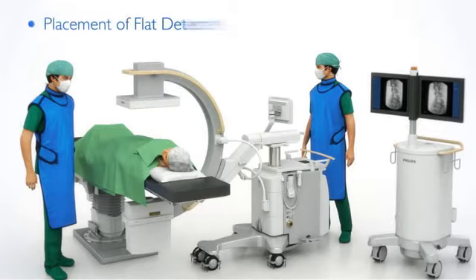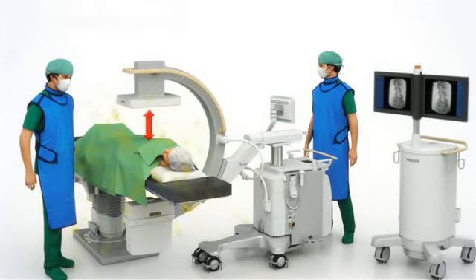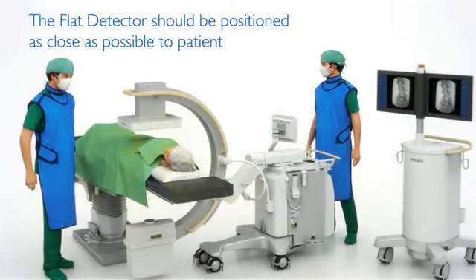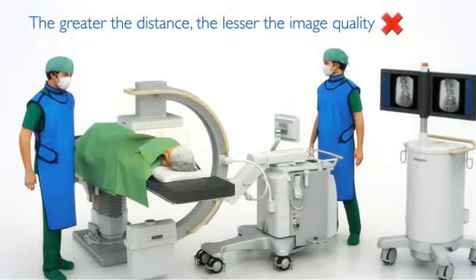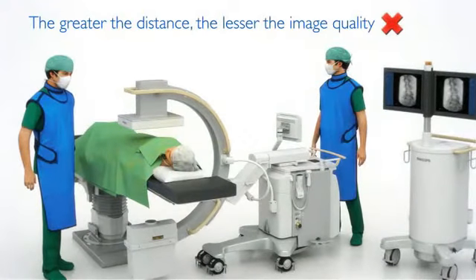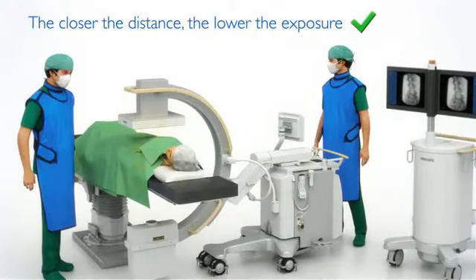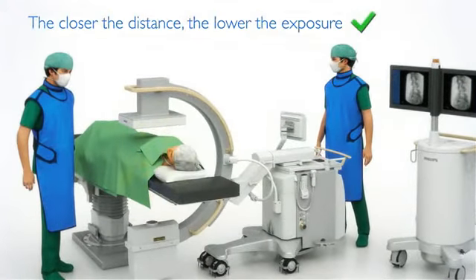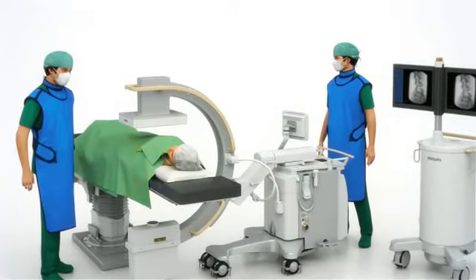The flat detector of the C-arm should be placed as close as possible to the patient. This proximity ensures that a full-scale and accurate X-ray image is created. The greater the distance between the object and the flat detector or image intensifier, the more the image quality is reduced. Also, avoid the use of thick silicone mattresses or pillows, as these act as fat tissue, increasing radiation exposure and decreasing the image quality.